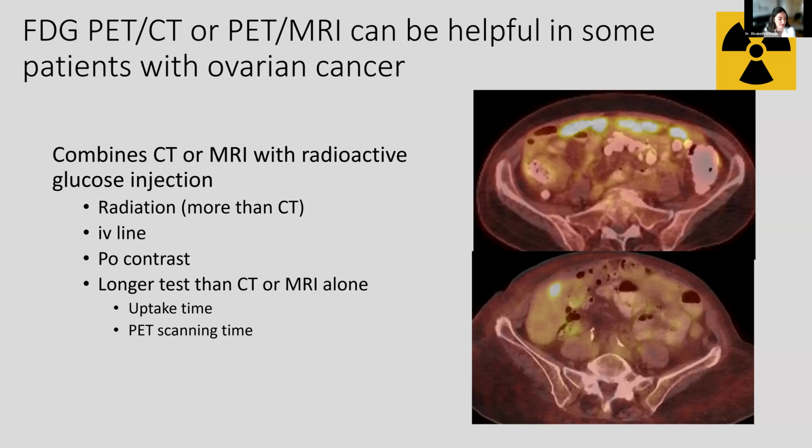I think it's very helpful in the setting of certain recurrent cases. There haven't been any studies in the literature showing it's a huge benefit in the primary staging setting. We'll show a good example, hopefully with time at the end, where it's been really beneficial. But it's nuanced, and it's not something we offer to every patient because it doesn't offer benefit to every patient. And the radiation dose, although not horrendous, is not inconsequential, so we want to limit it if it isn't necessary.